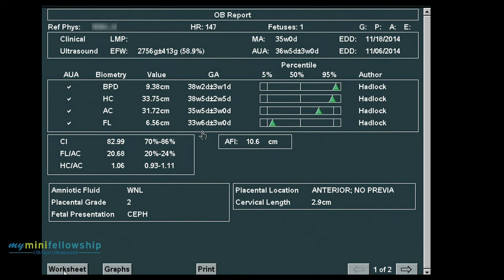But radiologists and obstetricians feel reasonably comfortable with the causes of big heads, which are hydrocephalus, large brain tumors, things like that. They're not expecting to miss hydrocephalus or a large brain tumor in a fetus where they just examined the intracranial contents. So they think that's out. It's not a big head. What it is, is a small femur, and they don't feel comfortable at all with skeletal dysplasia.